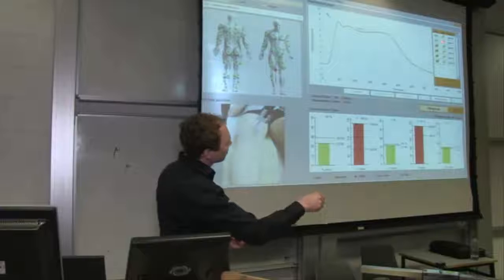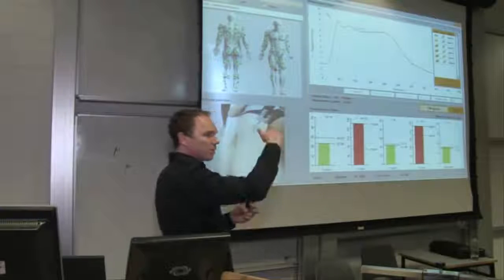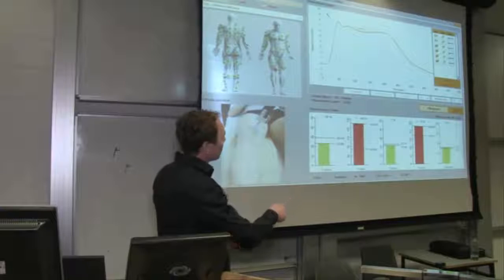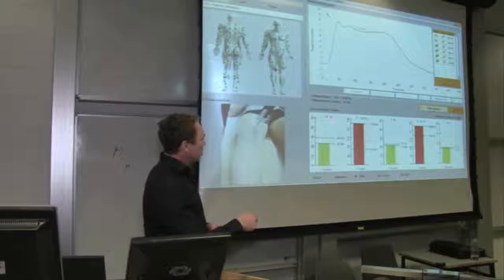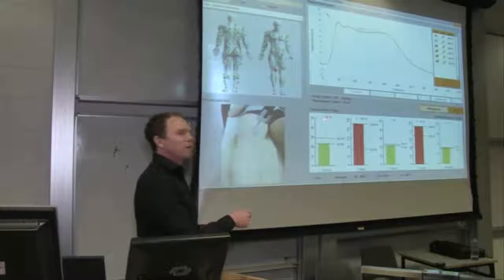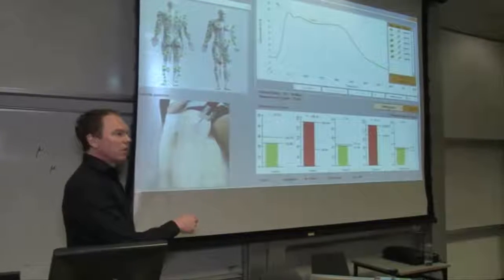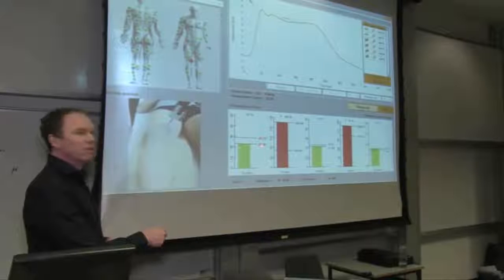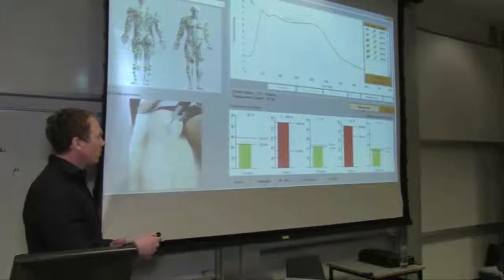So I have all the measurements here. The last one is always on top, so it's piling up. So it says graph 0. That's the orange one that I have here. And now I can look at the results, actually. So what I see here, in this case, it says this muscle is 20% faster than the average, because the reference value is 28. His value is below 23. So this muscle is much faster than the average, which is good.